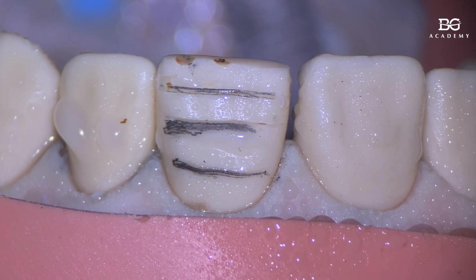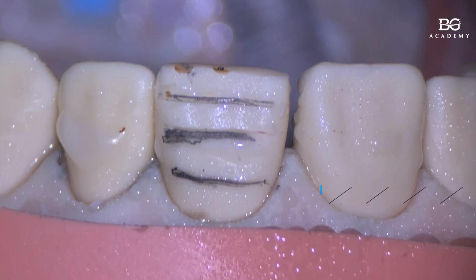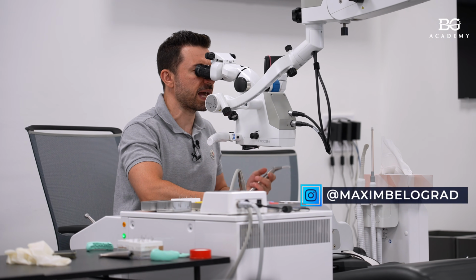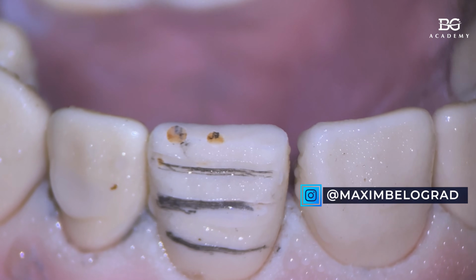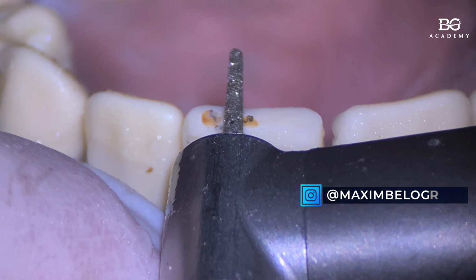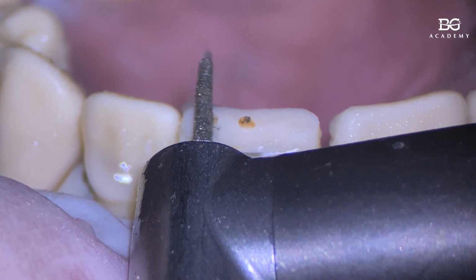Option number 2, you ask your patient to move the chin up. So you go with the chin up, really up. Then you move your microscope back, and you can get this view over the incisal edge. So basically you place the bur that way, and you go from left to right.